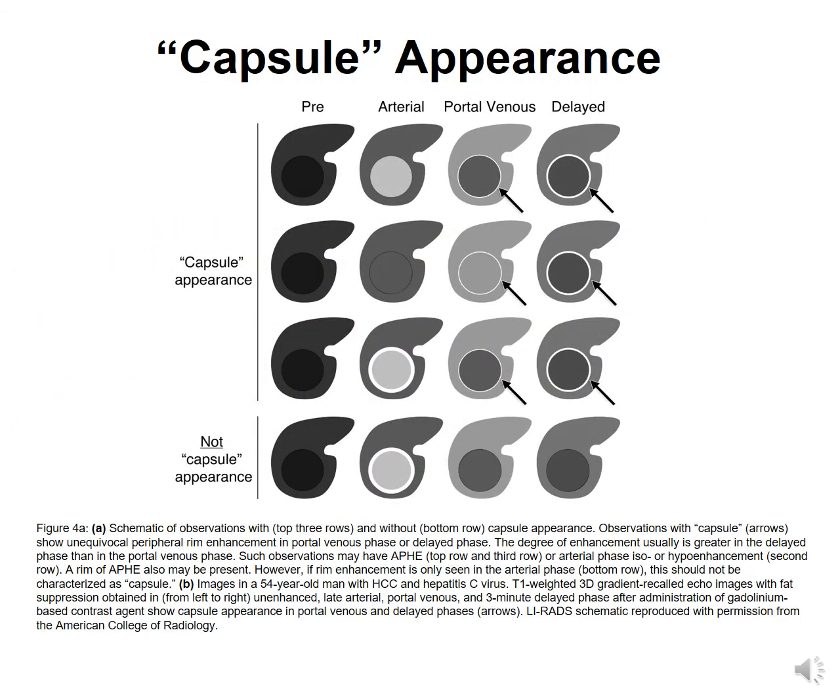Now the next feature is capsular appearance. Notice again that the capsule is in quotes, and that is because the rim enhancement does not always represent a true tumor capsule and may instead represent a pseudocapsule. This distinction between true and pseudocapsule cannot be made definitively on imaging, and it's only made on pathology. That's why LI-RADS favors the term quote-unquote capsule.